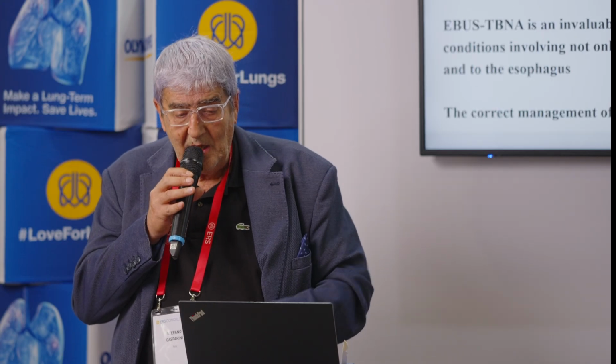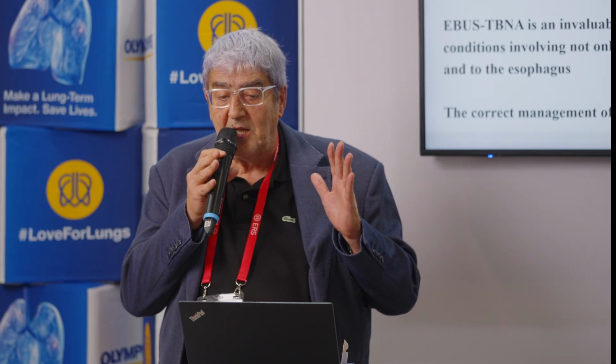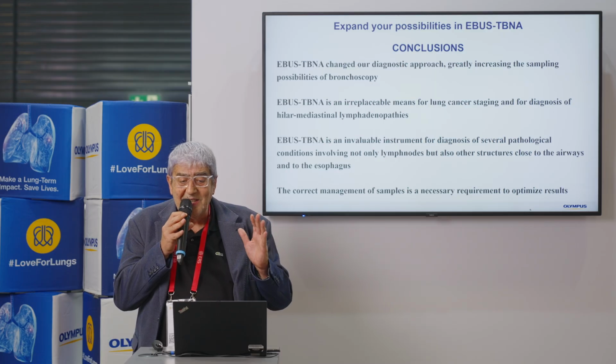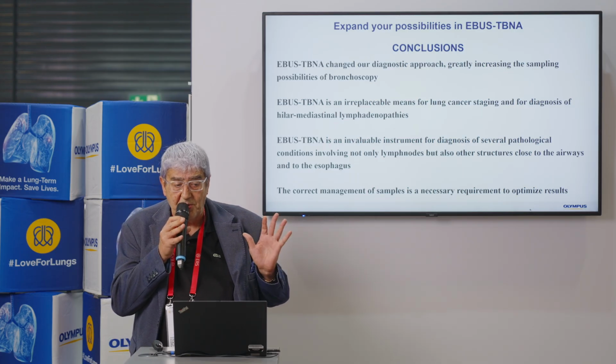Well, in conclusion, EBUS-TBNA changed our diagnostic approach, greatly increasing the sampling possibility of bronchoscopy.